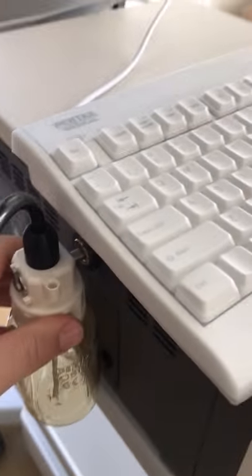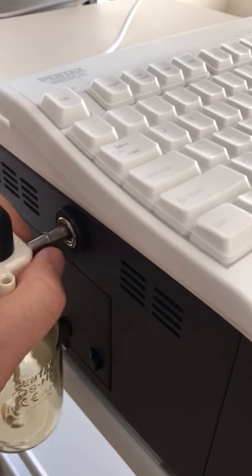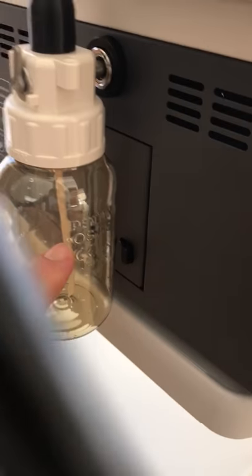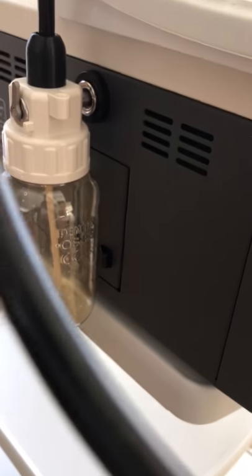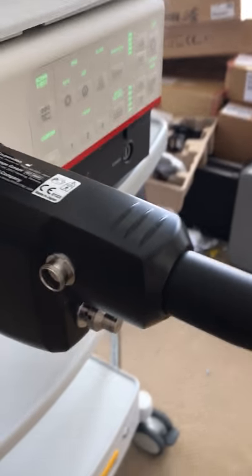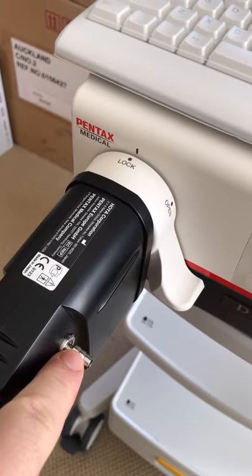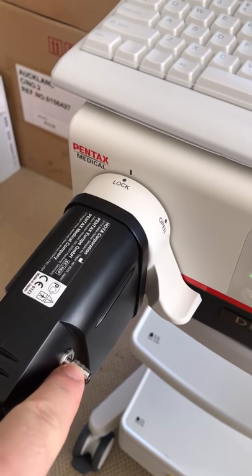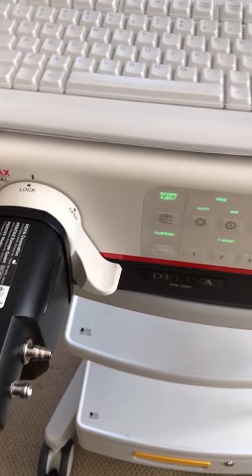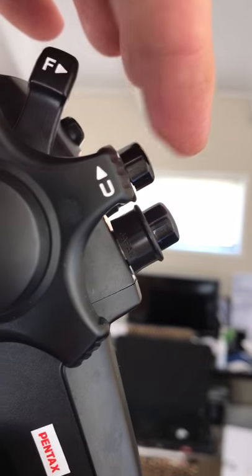On the side of all Pentax processors we've got a pump bottle. We fill it about halfway with saline or sterile water, click it in, and connect it into the scope. On the other side is where we'd usually have the suction pump connected. All of this connects into the control side of the scope, where we control the water, saline, suction, and air.